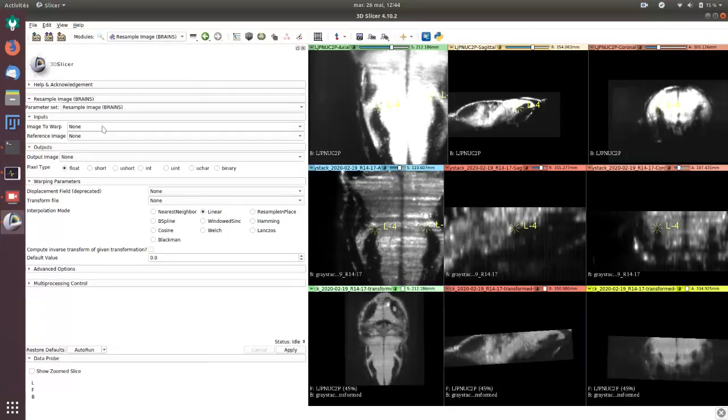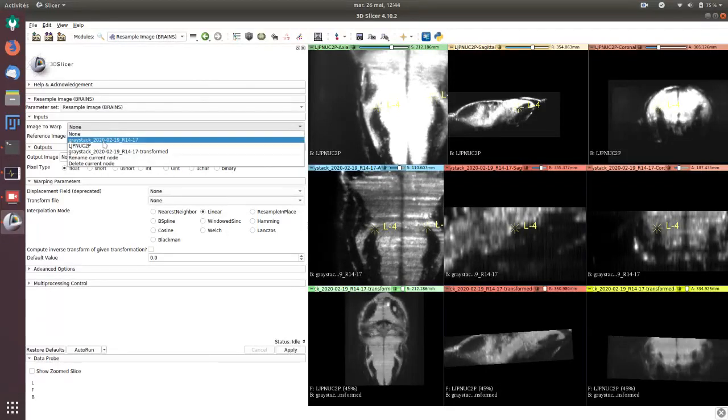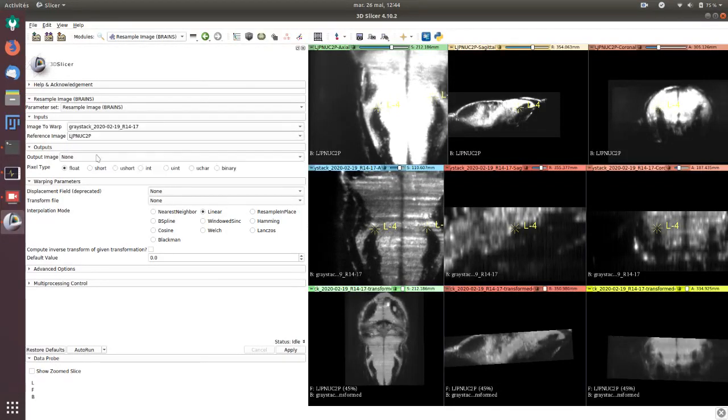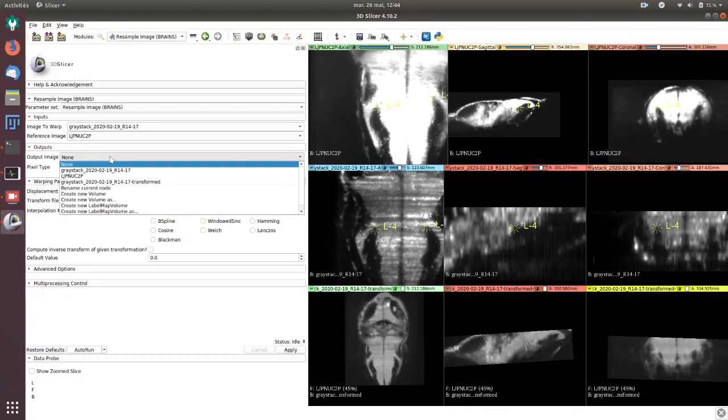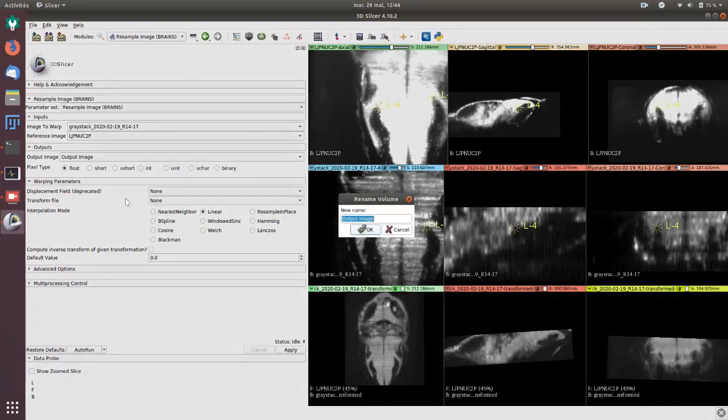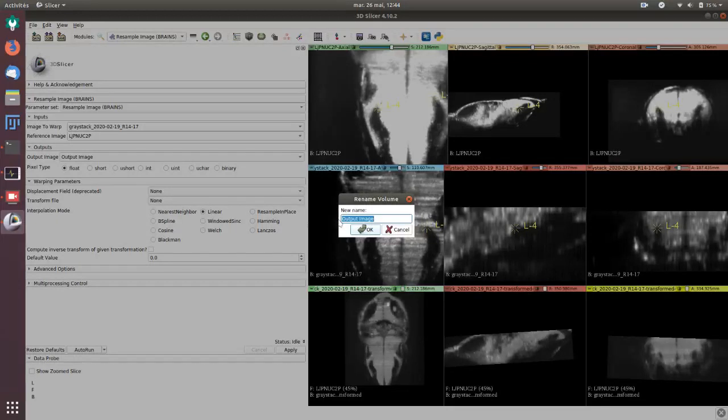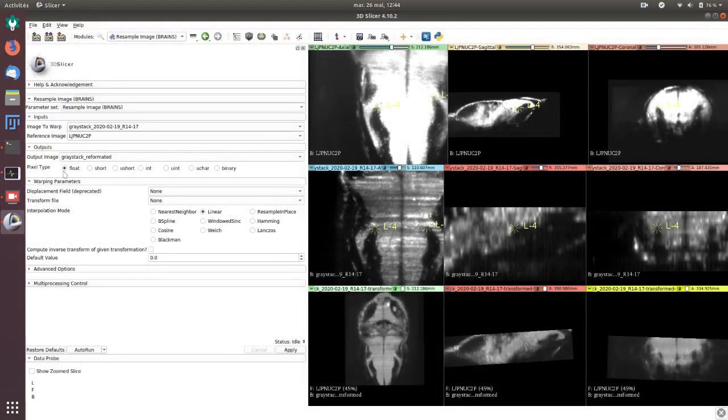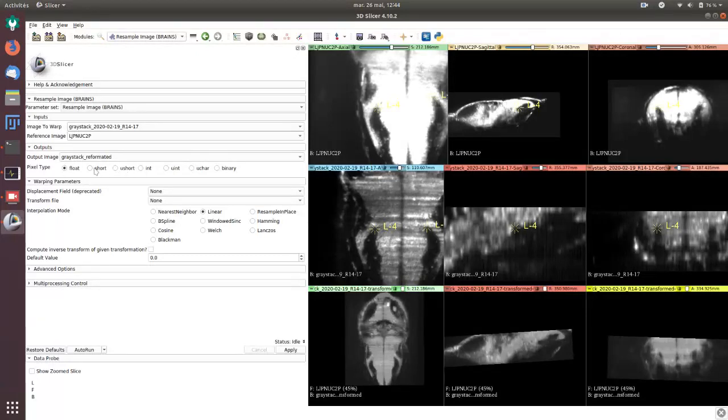I want to warp the gray stack on the LJPNUC2P and I have to set an output image. For example, I give it a name, gray stack reformatted.